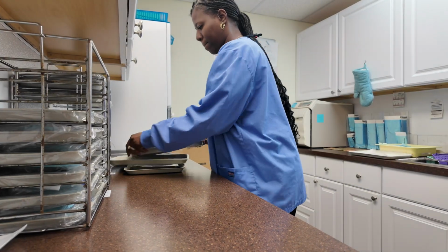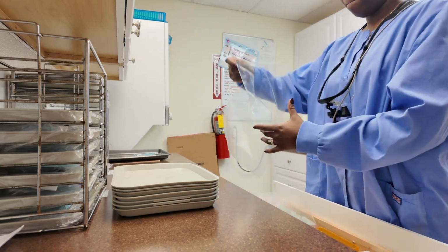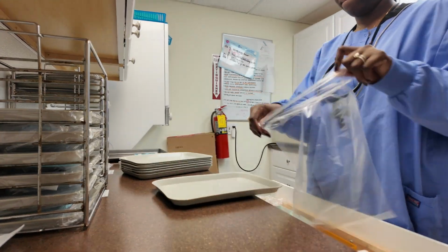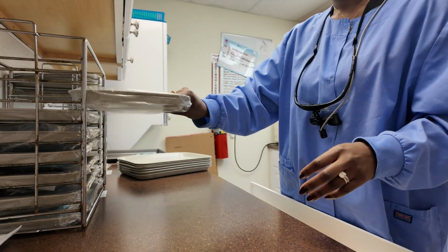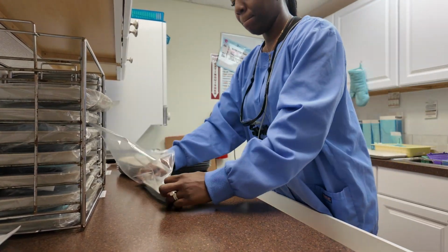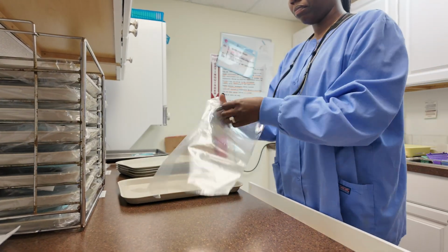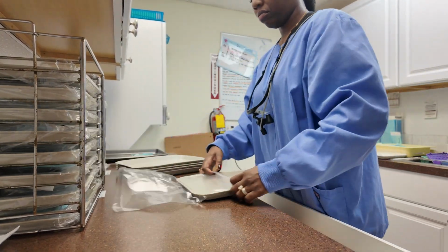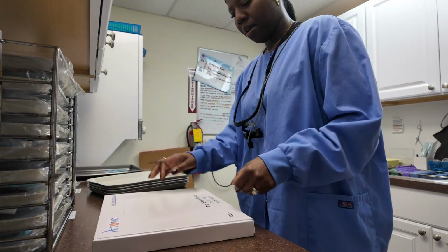So throughout the day, we are using these trays, and so we disinfect them in between each patient, but then we also cover them up with these tray barrier sleeves. That way no liquids are spilling, nothing is splattering, and we can just take the sleeve off and wipe them down for reuse again. So here I am just bagging those trays back up before I start to put the things that we need onto them.